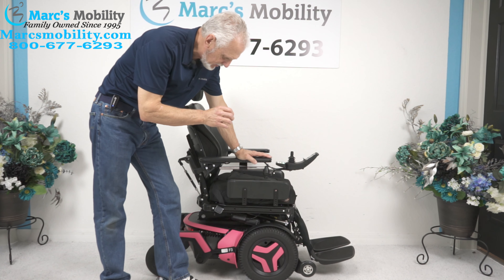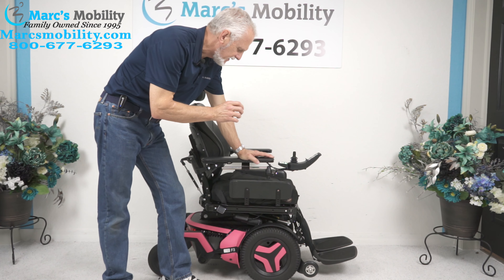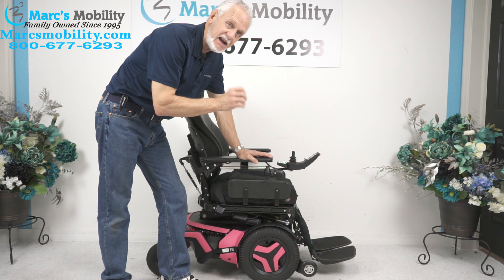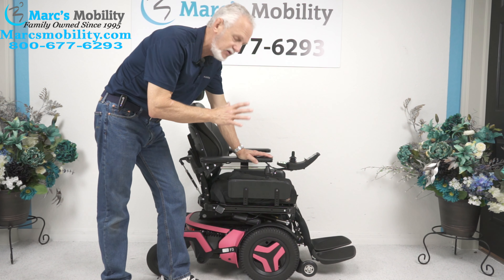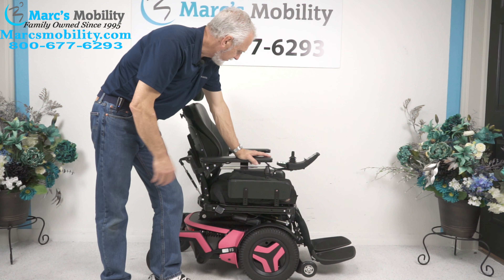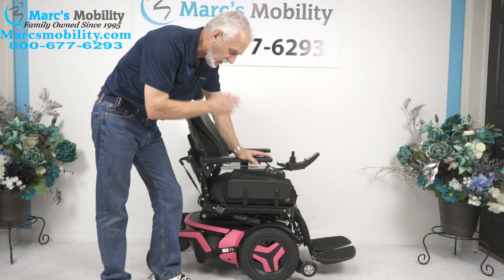We have here a Permobil F3 power chair. This power chair has four electrical functions. It has 84 miles, so it was used for about two or three months, but it's in brand new condition. It is pink — a beautiful power chair — and it's front wheel drive.